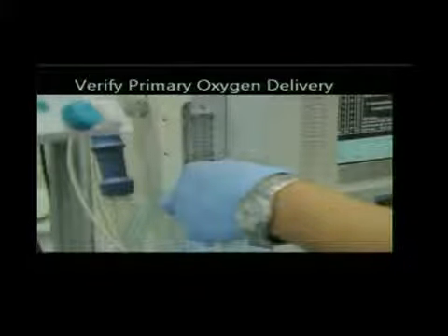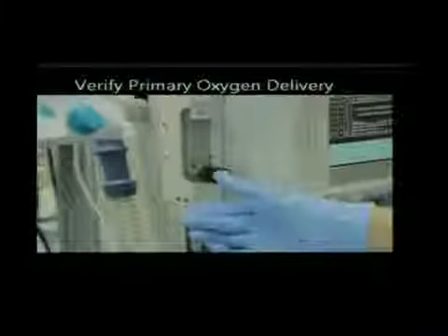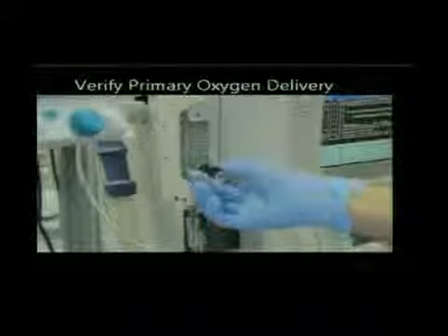The slide is entitled Verify Primary Oxygen Delivery. Yes, thank you. So oxygen delivery is key. And we have multiple sources of oxygen in the operating room. This right here is oxygen for a sedation case that will come through nasal prongs. And what you do is you have to see that, is it hooked up? Does the plumbing work? The anesthesiologist is responsible to be sure that this works. So, if you continue, please.